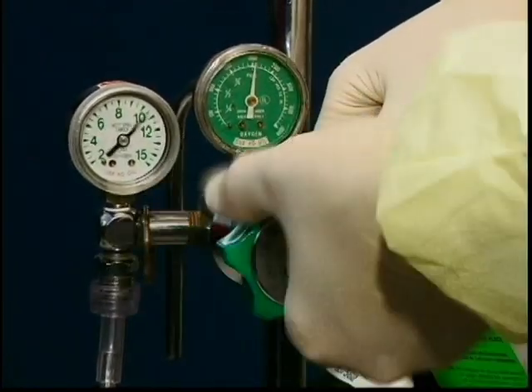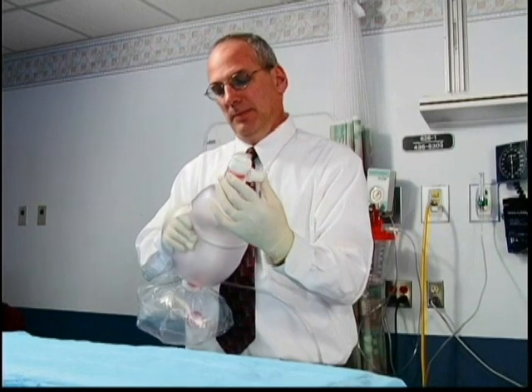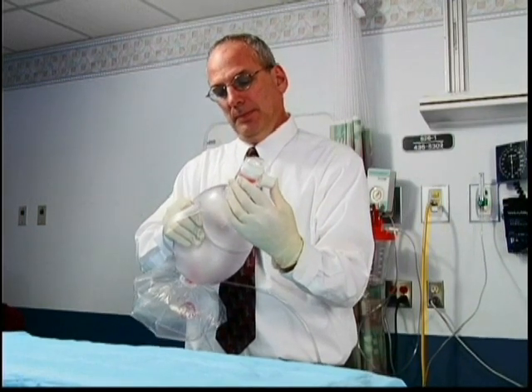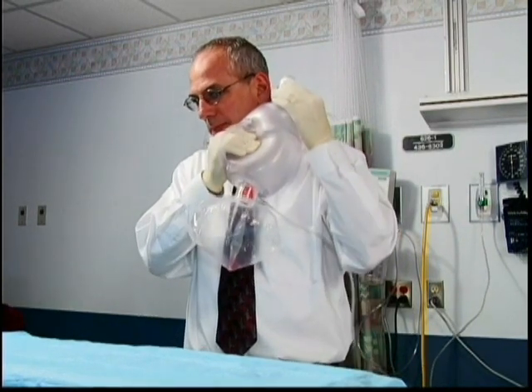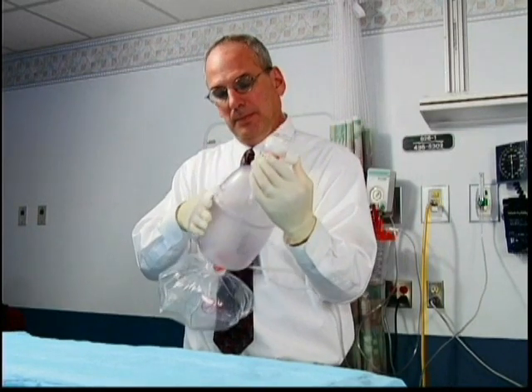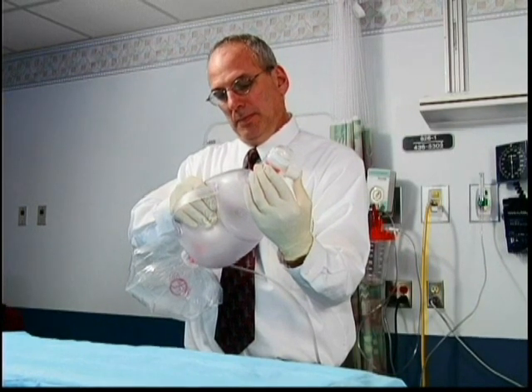Be sure to turn off the flow meter following use. To determine proper function of the bag itself, occlude the bag at the outlet with your thumb. Squeeze the bag with your other hand. You should feel resistance in the bag as the result of your thumb occluding the outlet, simultaneously listening for air leaks. No air leaks should be detected with your thumb occluding the outlet, which assures that the bag's valves are functioning correctly.